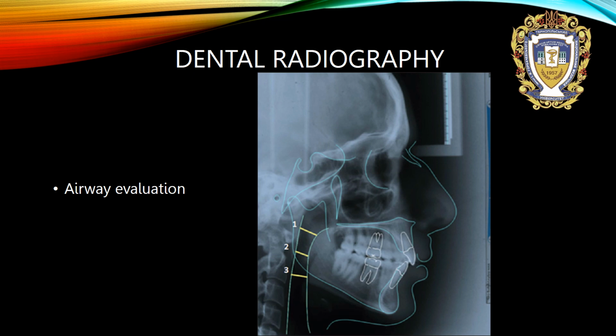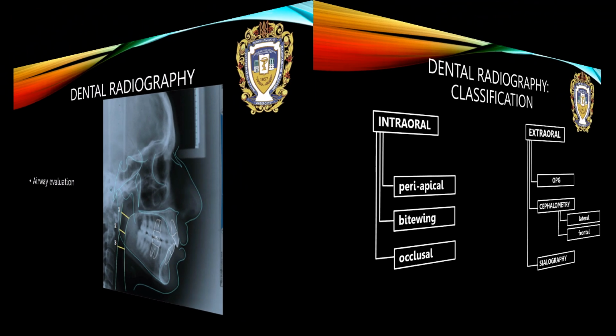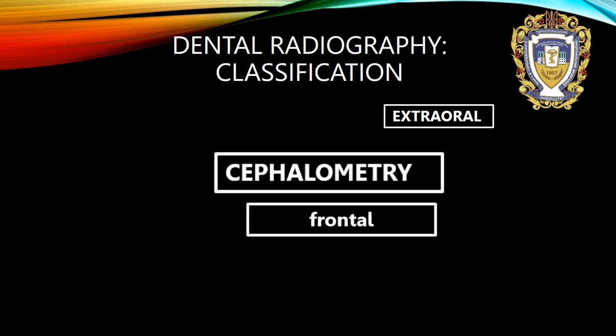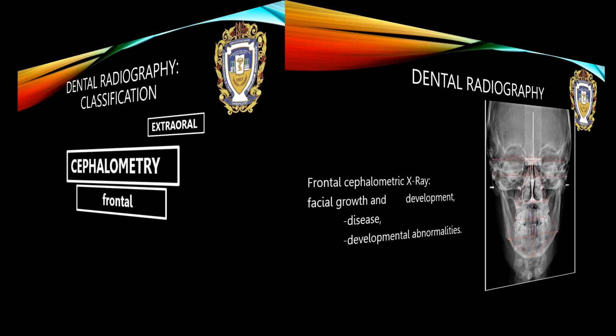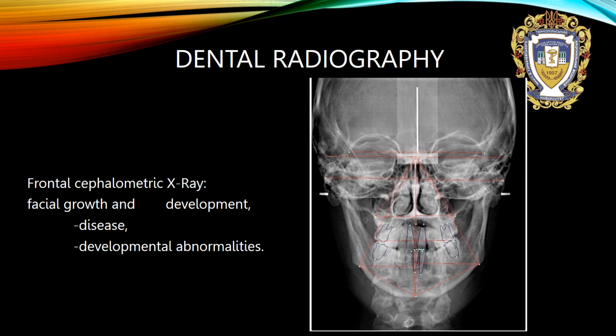Moreover, lateral cephalometric X-rays we can use for airway evaluation. And a frontal cephalometric X-ray is used for facial growth and development evaluation, disease and developmental abnormalities.